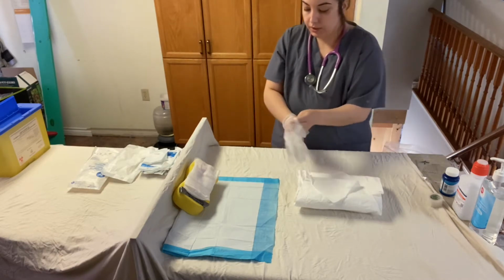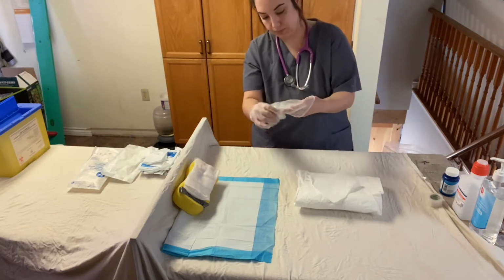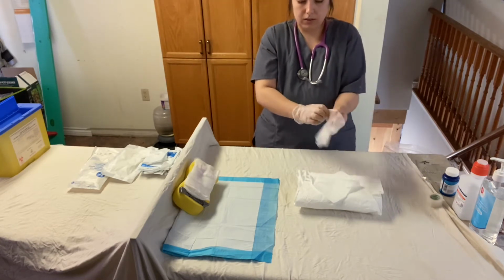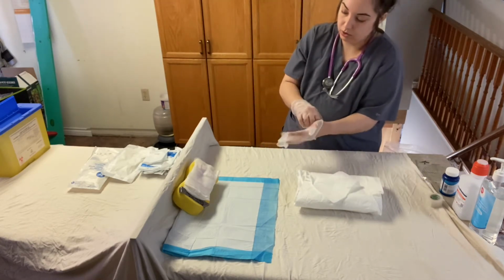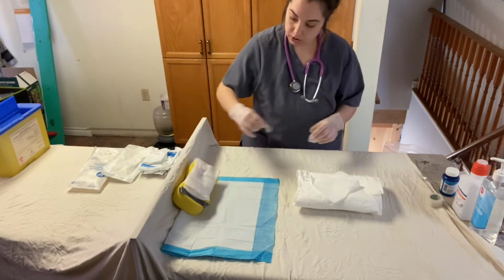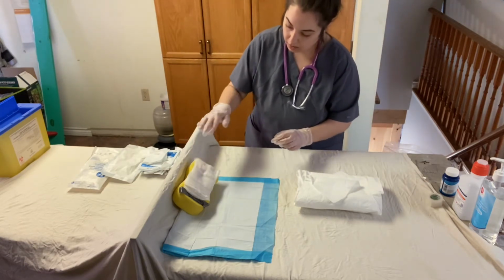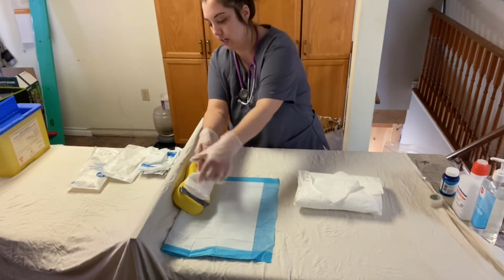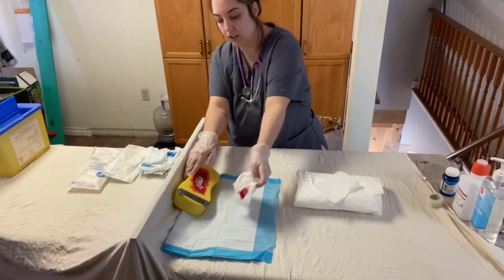Okay, are you doing okay there, Robert? Perfect. So I'm just going to be assessing the wound dressing here. The outside of the dressing seems to have a little bit of dark, dry blood. Nothing to be too concerned about there, Robert. You might feel a bit of discomfort with the tape. I'm just going to take off the dressing.